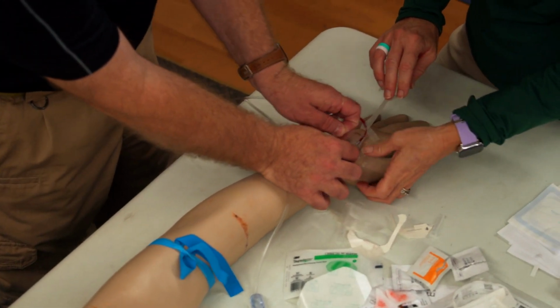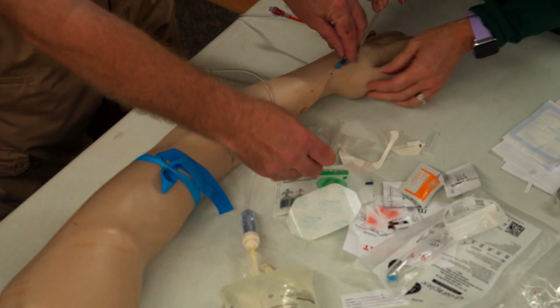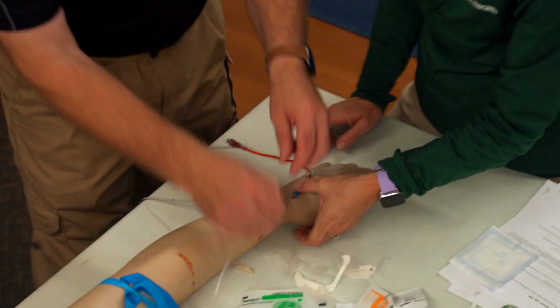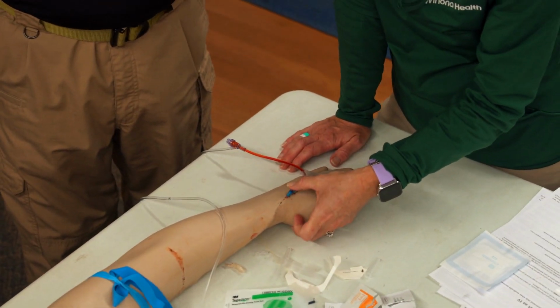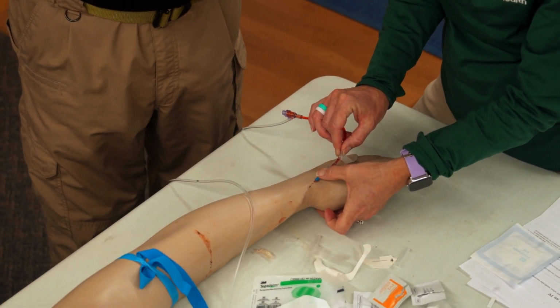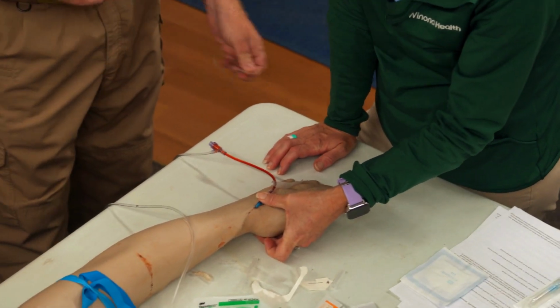Right, because for me, when I first started, we didn't have the Tegaderm, so I would do that very same concept. Because that tape is putting the back pressure on that. It takes more to rip it off, except in some of our cases, it's pretty easy. But I do that exact technique. Before the days of the Tegaderm, I did the very same thing.